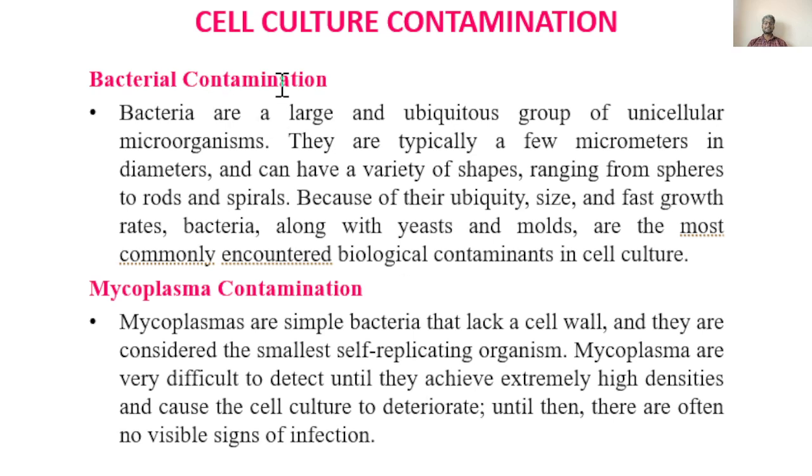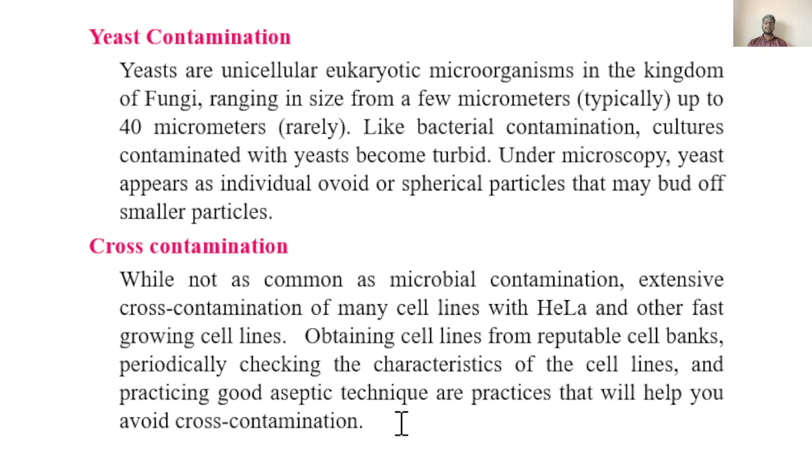Cell culture contamination is another important segment. Bacterial contamination is the first and foremost that people have to address. As I said before, antibiotics are not required, unless a laboratory repeatedly encounters contamination. Bacterial contamination, based on its morphology and pattern, we can easily identify with a microscope. Likewise, mycoplasma is also a bacteria, but it lacks a cell wall and cannot be identified using a microscope.